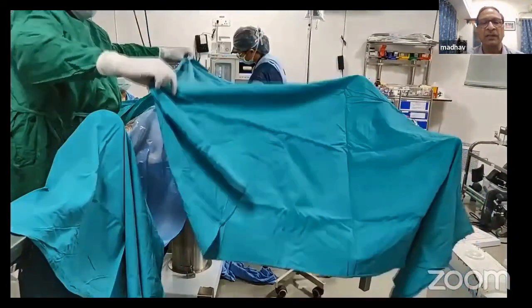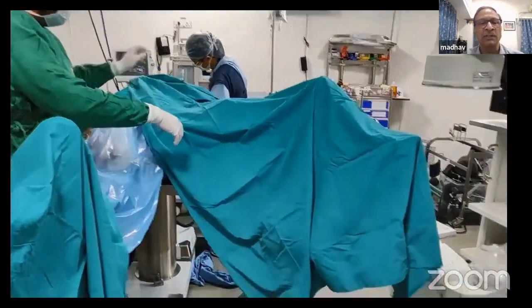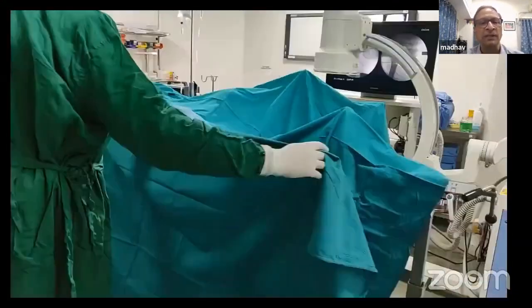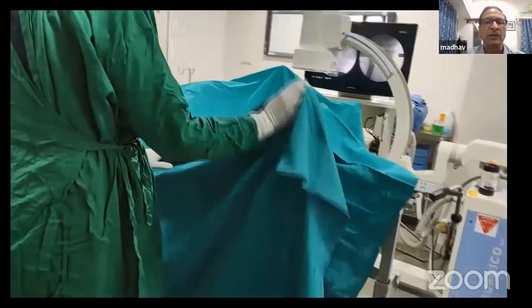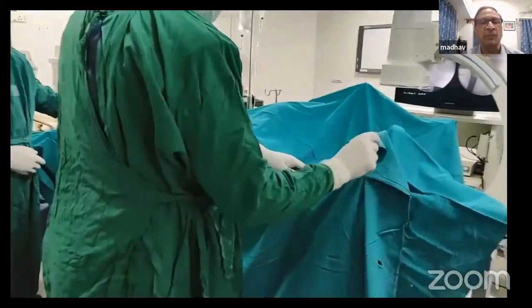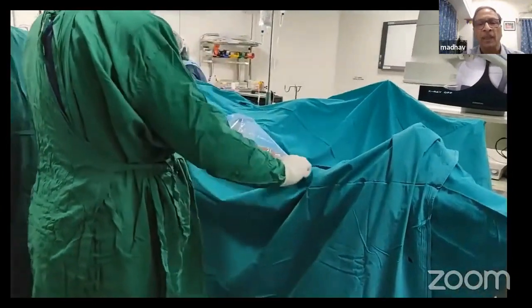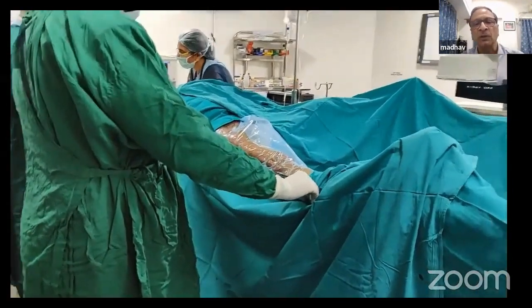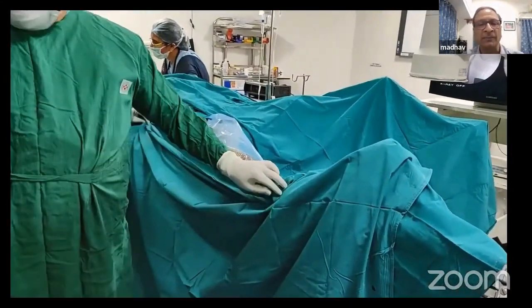Now you take a big sheet and cover the distal extremity below the knee. One big sheet is taken to cover the upper part of the body. A third sheet is used to cover the opposite limb.